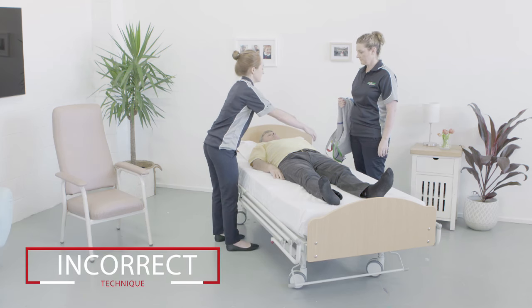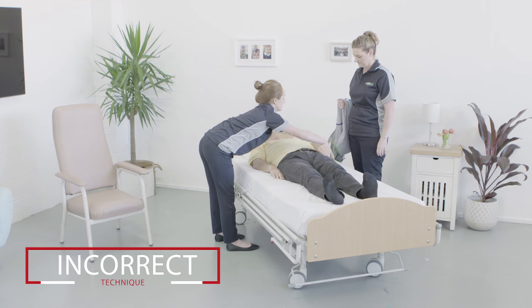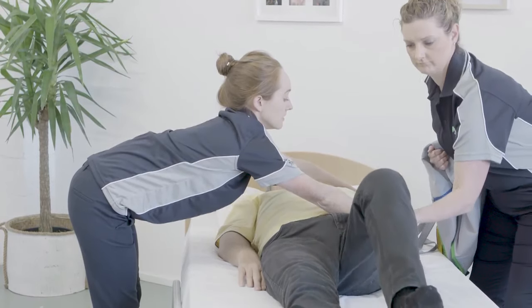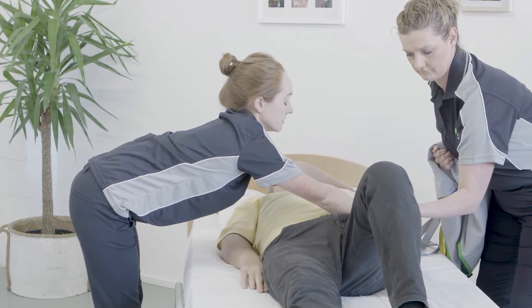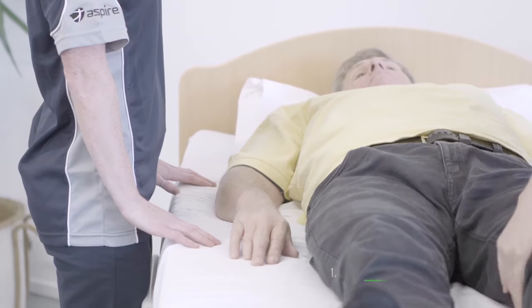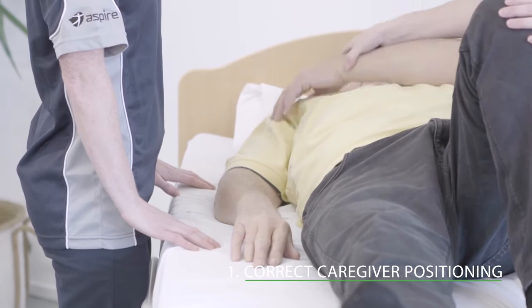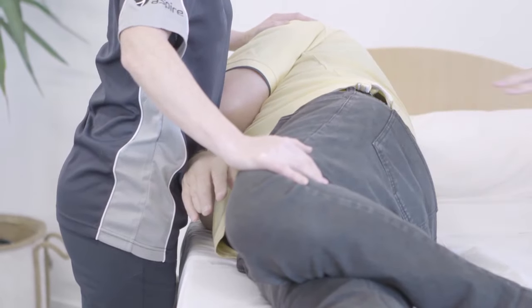You should also think about your positioning and your safety. This is an example of unsafe caregiver positioning and puts you at risk of harm. Notice how the caregiver is too far from the bed and is significantly leaning over to assist rolling — her back is not protected in this position. Always ensure that the bed is at a safe working height and that you can stay close to the resident to avoid leaning or bending and protect yourself from injury.